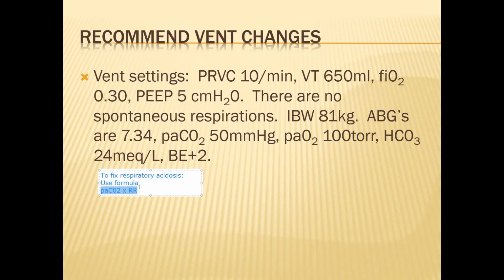Okay, so if we're not going to be changing the tidal volume, we're good, right? Because we're 81 kilograms and the tidal volume is 650 ml. Can you do a side calculation?